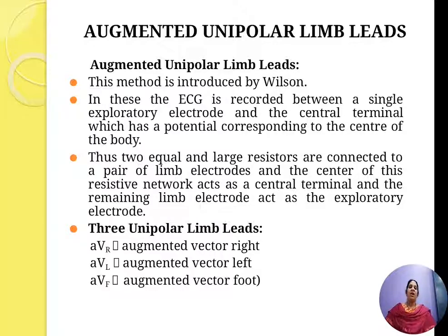What is AVR? Augmented voltage right, or vector right, whatever it may be. Augmented voltage left, and augmented voltage foot. All these are vectors, so you are representing them as vector foot. AVR, augmented vector right; AVL, augmented vector left; AVF, augmented vector foot.